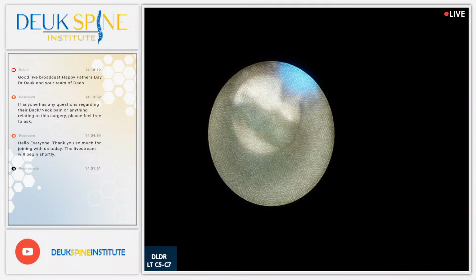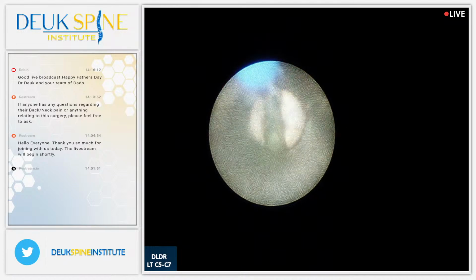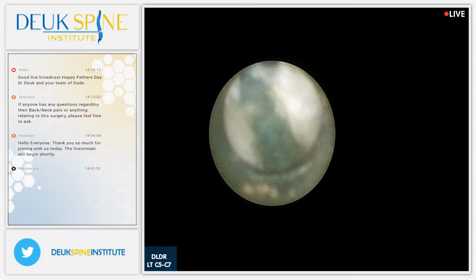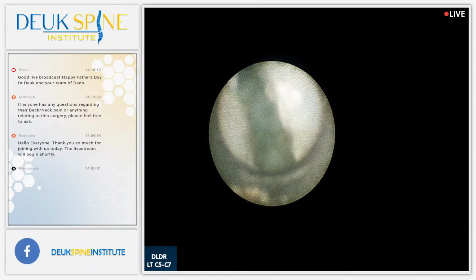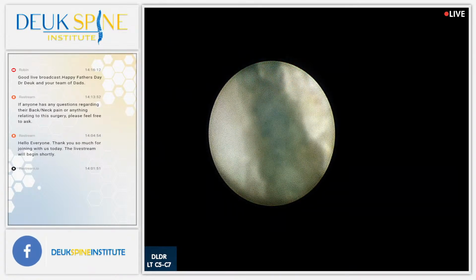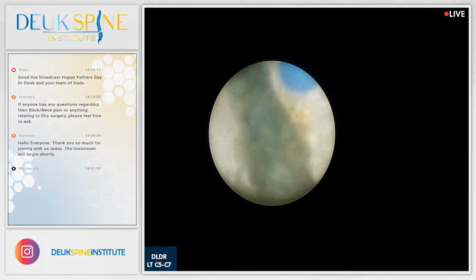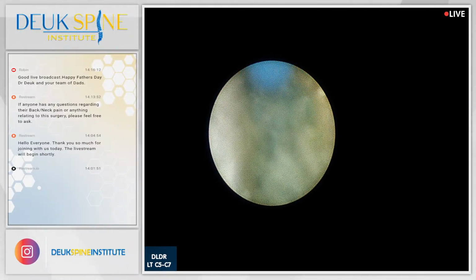Just about done with this one. Now, this is 5-6, right? So we're going to have to go down one. 6-7, correct? So that's going to be the challenging moment of the surgery, is getting down to the next disc, which I expect to be able to do.